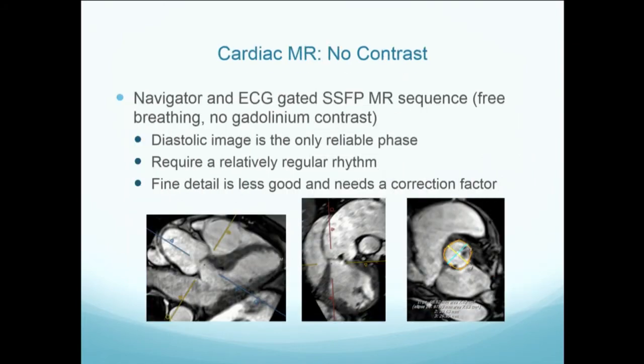What about cardiac MR? We do this frequently, not for this indication, but there's something called a navigator and ECG gated sequence that has no gadolinium and it's free breathing.